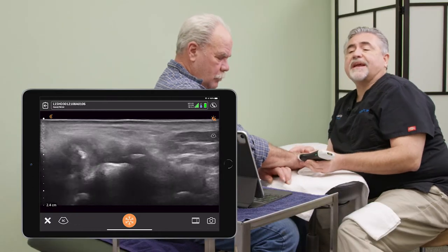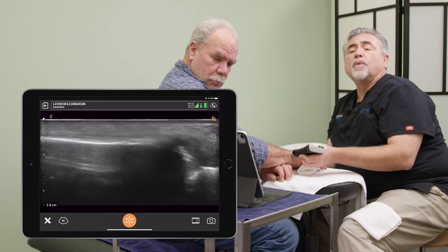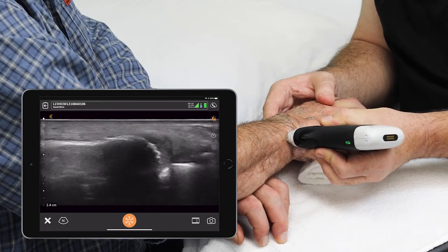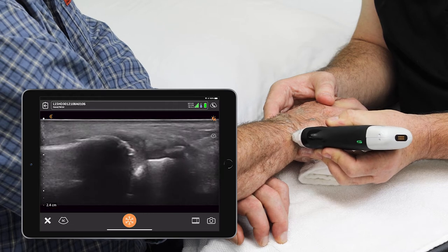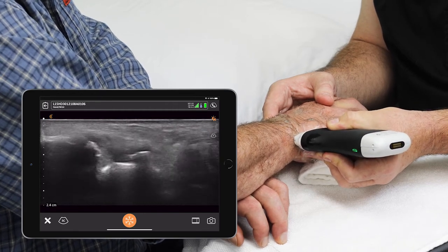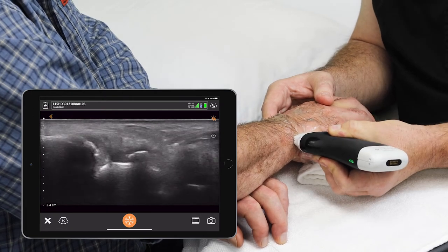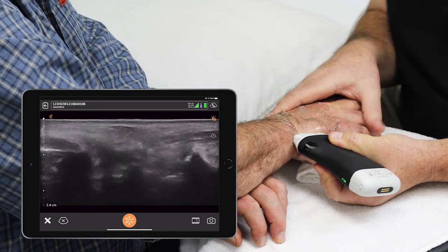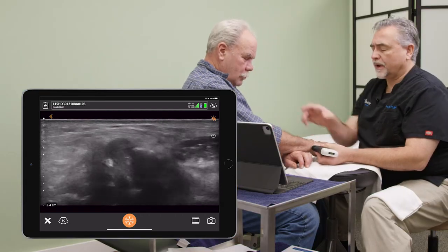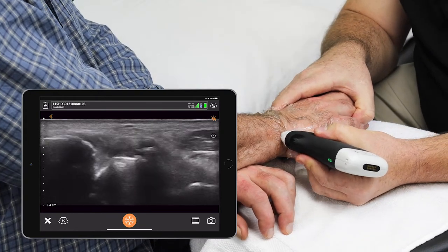Next I'm going to go long axis. The top white line is the distal ulna, and as we drop off the distal ulna we're going to come onto the triquetrum — the carpal-ulnar joint. I'm going to radially deviate, having Randy leave his elbow in place while I turn his wrist just a little bit to open that up.